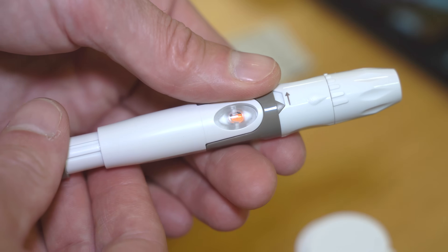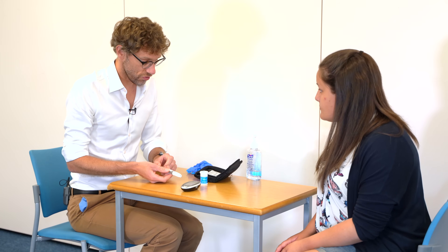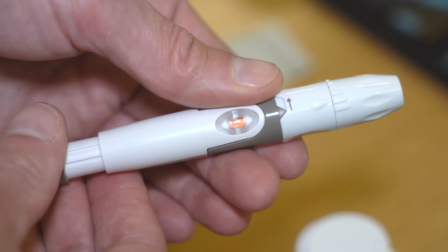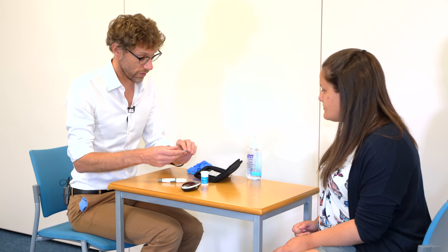In order to fire it, we'll pull back on the plunger and then press that button. That flash means it should have fired. When we pull up, you can see the yellow to show that everything is primed. As we do that, you'll get a small dot of blood which we'll then put onto the test strip here and that'll give us our number.